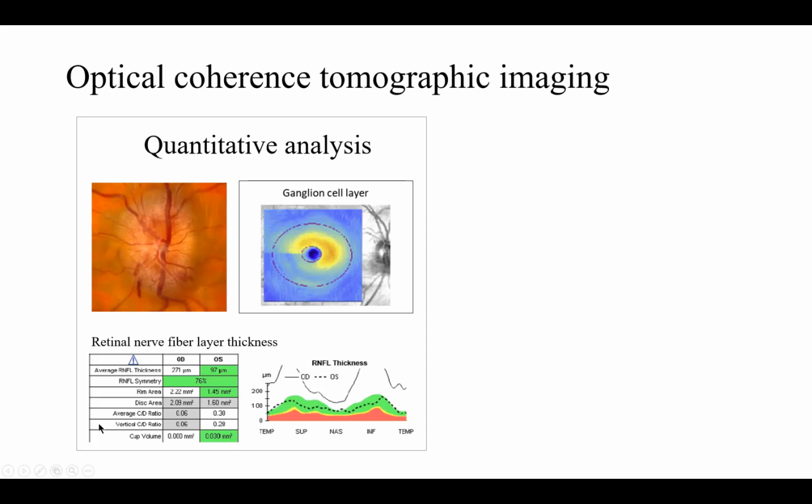The OCT has enhanced our ability to manage a variety of ophthalmic conditions, particularly macular diseases, glaucoma, and other optic neuropathies. The application of the OCT has principally relied on summary metrics, specifically the mean mRNFL, or retinal nerve fiber layer thickness, and the ganglion cell thickness, which I'm only going to touch on very briefly in this talk.